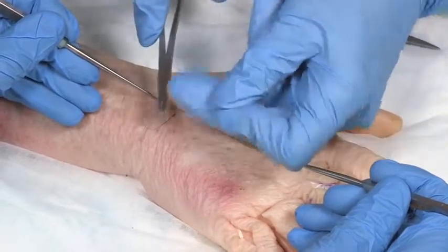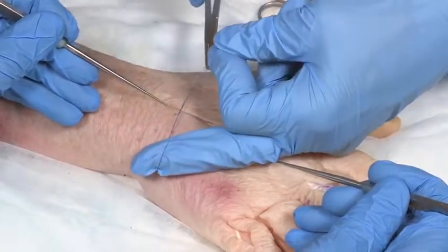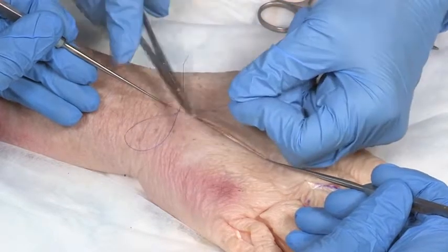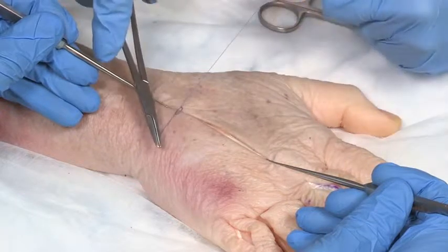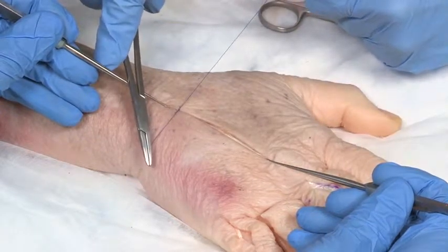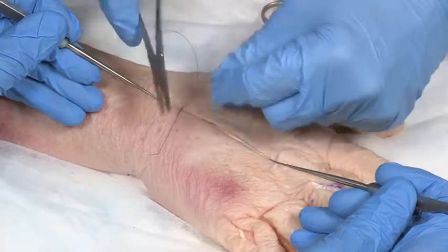When the incision edges are well approximated, it's appropriate to pass the suture through both edges of the skin in one smooth movement. Otherwise, the needle should be brought out into the wound and repositioned before being passed through the second skin edge.